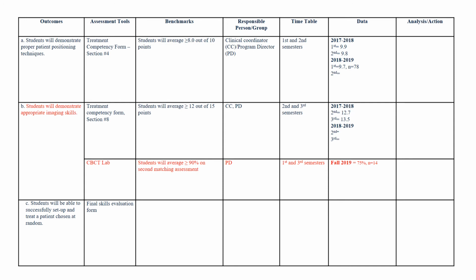In order for me to assess a student's competence, I sit down with them in a lab at our university, and we have the VERT software. I can run a sample patient with some error that puts the patient out of the correct position. I use this as an opportunity to teach the student how to use the software and the interface. And I have parameters that I expect.